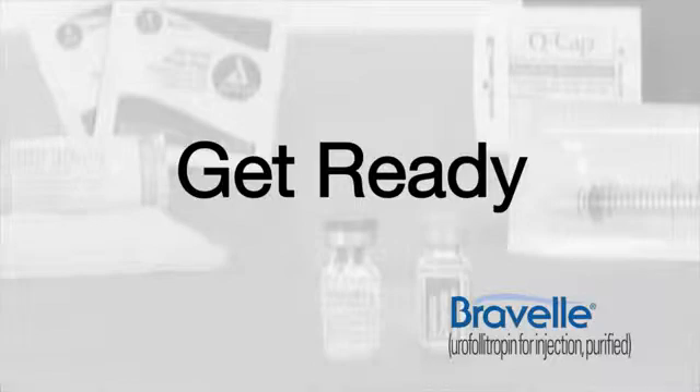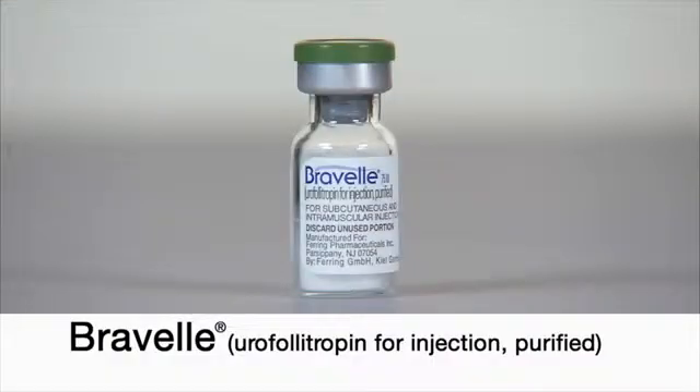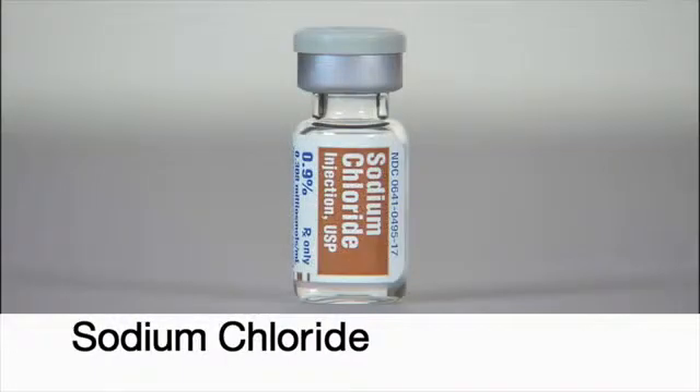Get ready. Wash your hands well with soap and water. Use alcohol to clean the surface where you will be working, and gather one or more vials of Bravelle, depending on your prescribed dose, and one vial of sodium chloride.